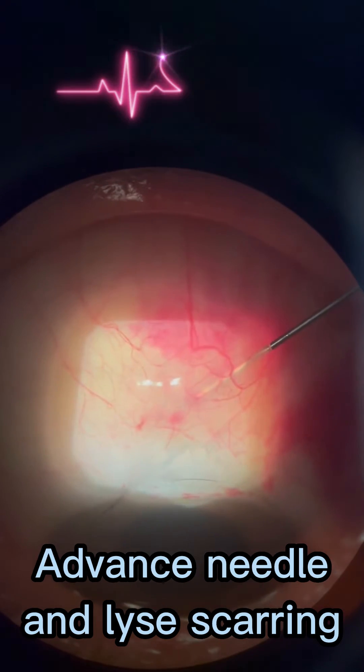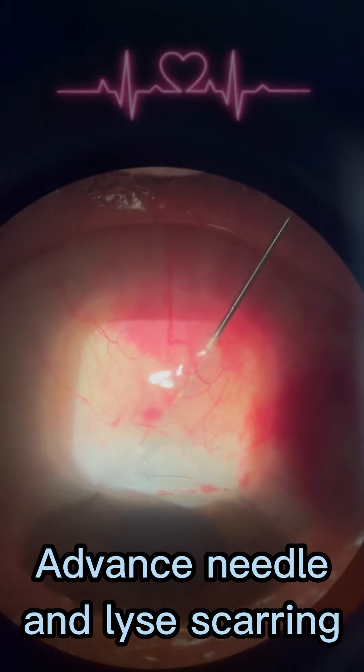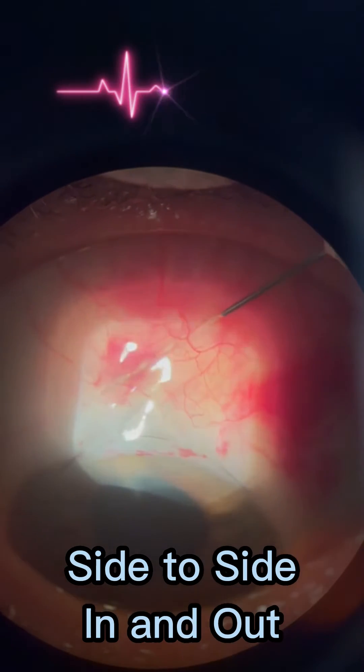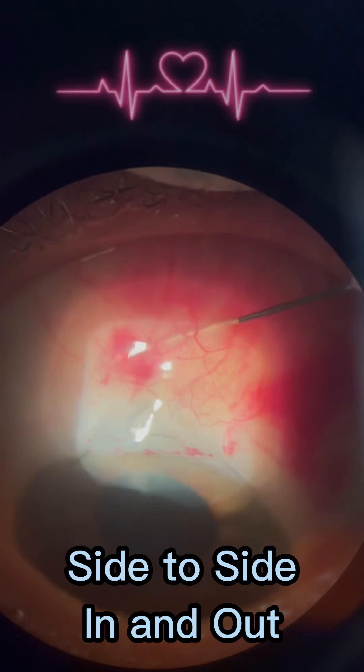I'm just lysing scar tissue here a little bit. Trying to get some posterior flow there. You can see that the amount of lidocaine injected is spread.